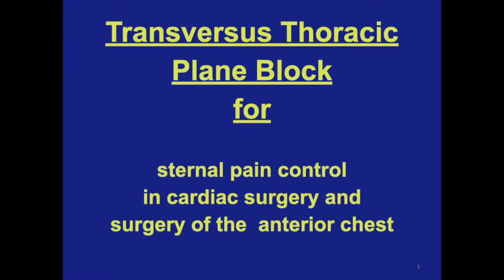Transversus Thoracic Plane Block for sternal pain control in cardiac surgery and surgery of the anterior chest. My name is Gabor.